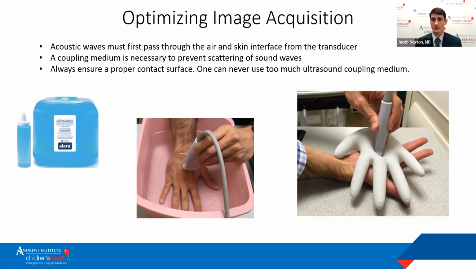One of the things I learned very early on in my training, and the more I've used it both in the emergency department and the sports medicine world, is you can never have too much gel. If you feel that you haven't put enough gel on there, you should put a little bit more gel in order to improve the quality of your image.